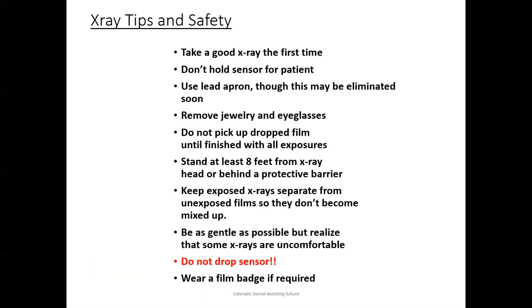Be as gentle as possible, but realize some x-rays are uncomfortable. You want to go as quick as you can. If you have a patient that gags easily, we can sometimes numb the back of their throat. To be honest with you, it's not always that fun to use that anesthetic spray. So if anything, if they're more comfortable and they want to hold on to it, that's okay. But sometimes you have to place it in there and talk them through it. It's all about you making the atmosphere something that they enjoy and they feel comfortable in.